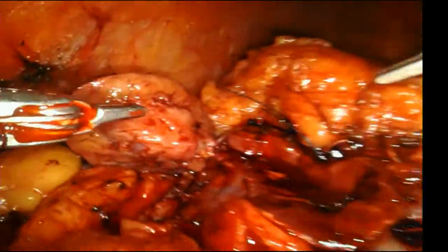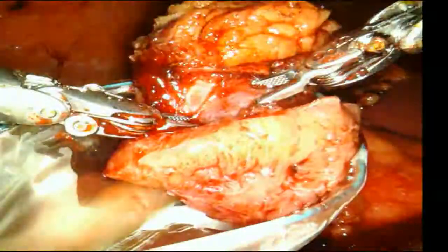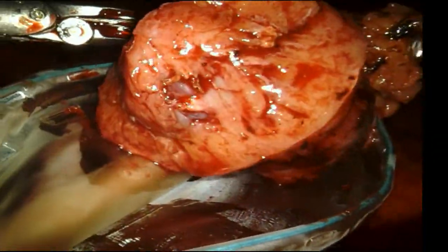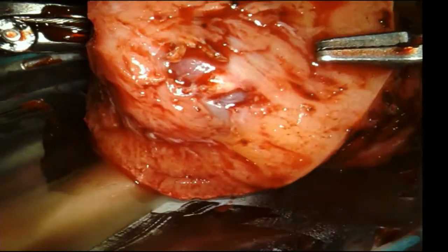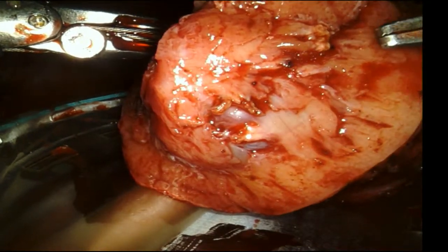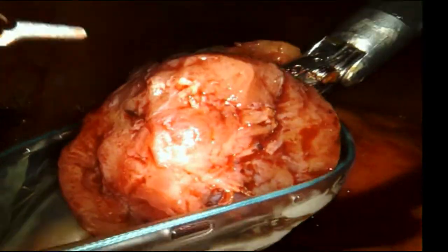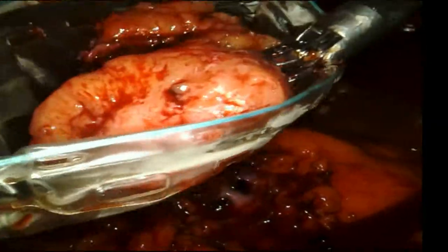All right, so I think we can bag this. So again, this is our margin. You see here's tumor. Green is good. And again, I was showing here before we bag it, this is where we're getting really close to the tumor, right in the middle there. You see that? There's still some kidney on it. We're not into the tumor. It's still pseudocapsule and whatnot, but you can see how it doesn't fluoresce like the rest. So if you had actually cut into tumor, that's what you would see: a dark spot where you cut into the tumor. Okay, and then let's bag the fat.